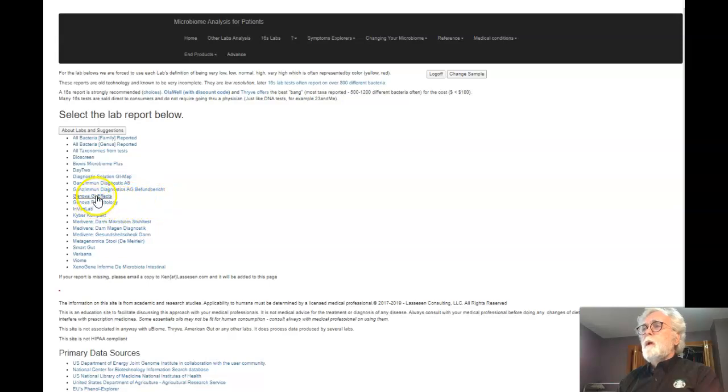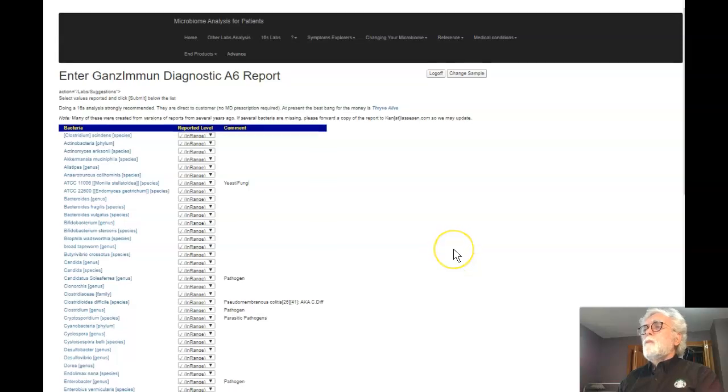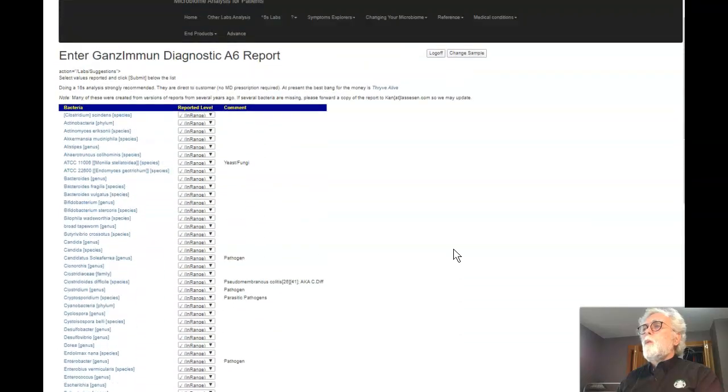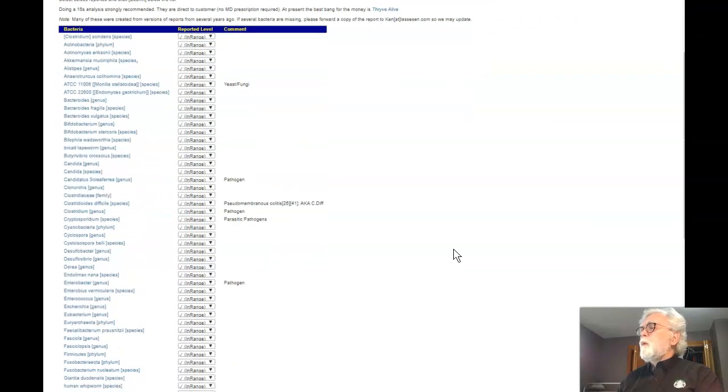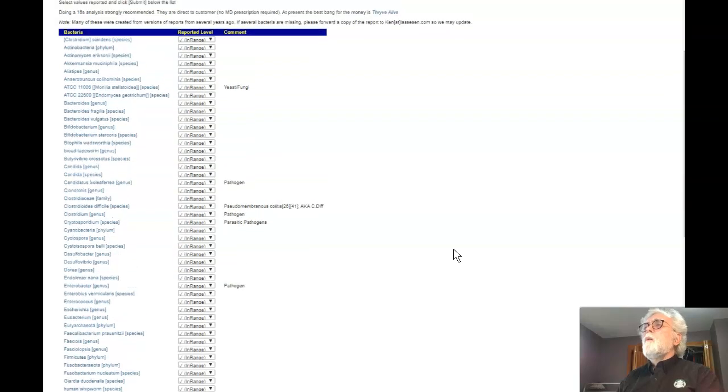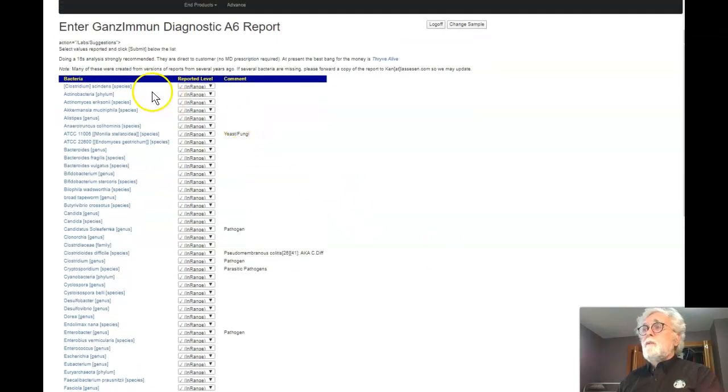Okay, so what we are going to do is go down and look at this German report, and if I click on it, you will in a moment see all of the bacteria which are reported in the report. Some of these you'll find maybe only in 12 or 18 items. Others you find in massive lists. This is one of the bigger lists. So what we have here is all of the bacteria, or in some cases tapeworm, whatever, which is in the variety of reports.